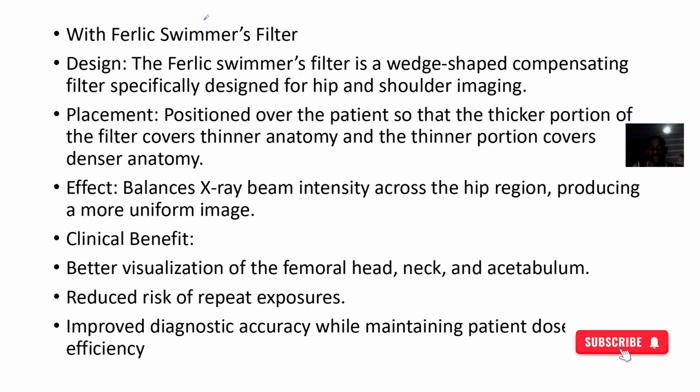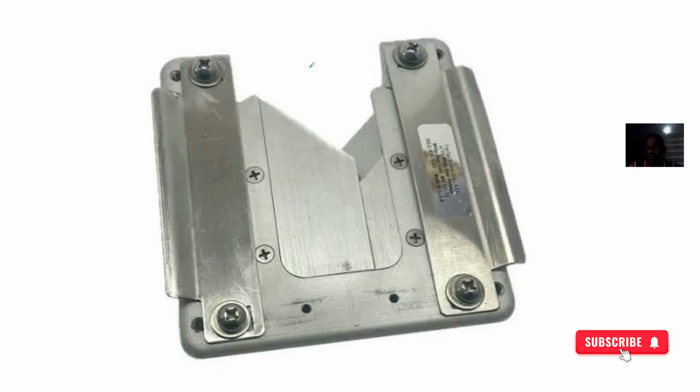The effects, we've spoken about that. You have better visualization of the femoral head, the femoral neck and the acetabulum, and you have a very neat image, so there's no need for repeated imaging. There's also improved diagnostic accuracy, where you are able to make a decision that is much more valid.